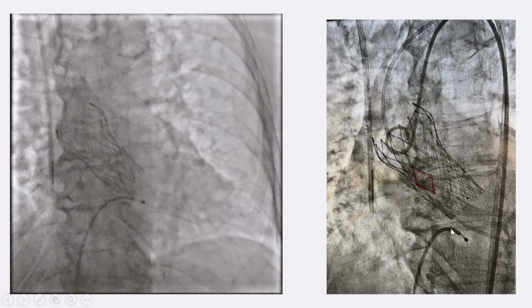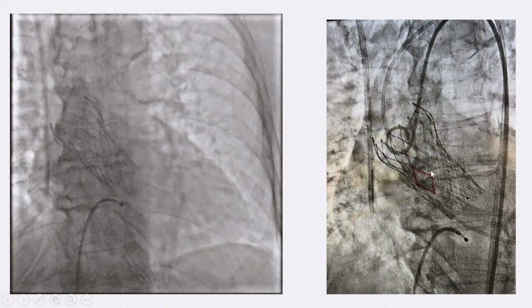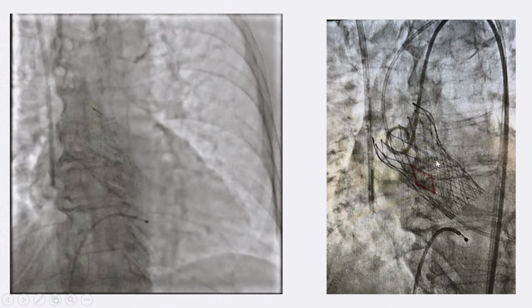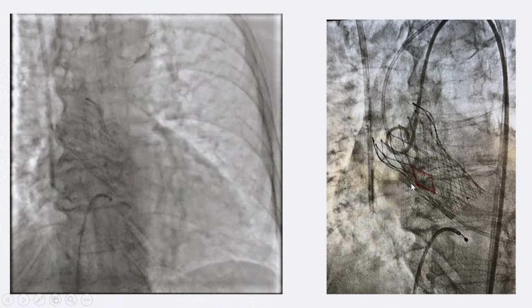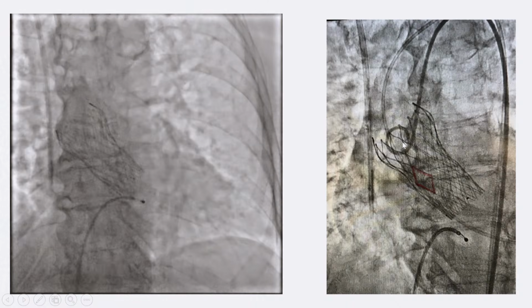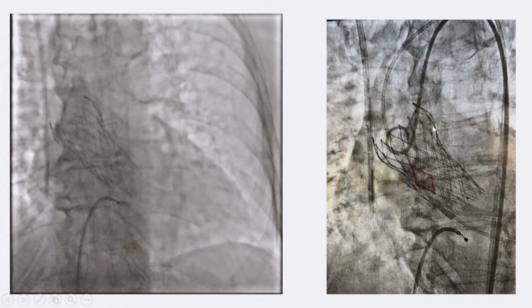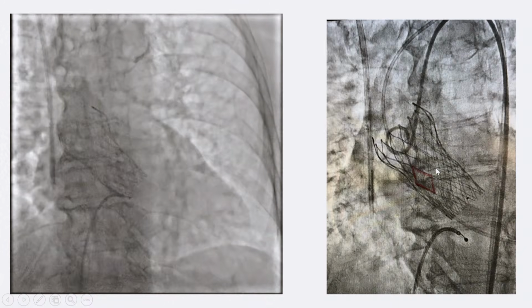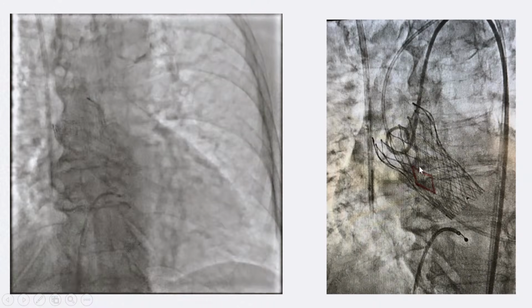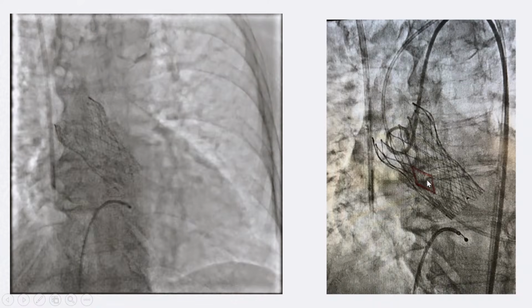And this is just another image because we use the Evolut FX platform. These have 3 large windows here, which basically give us good access to the coronaries either during index procedure or for future interventions as well. It is quite useful. It is also very useful in horizontal aortas because it's more flexible. And also the patient prosthesis mismatch chances are much less, and paravalvular leak cases are also much less after using an Evolut FX valve. So the one which is marked is the larger windows, which helps for the coronary access.